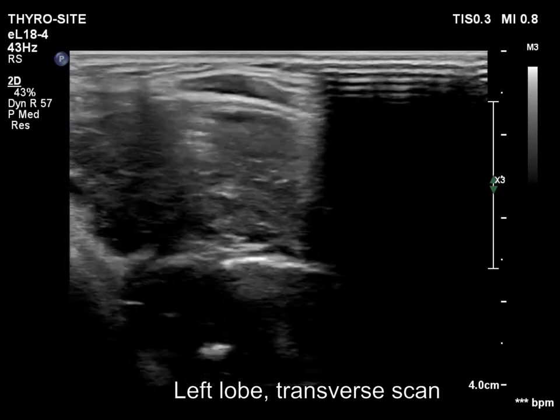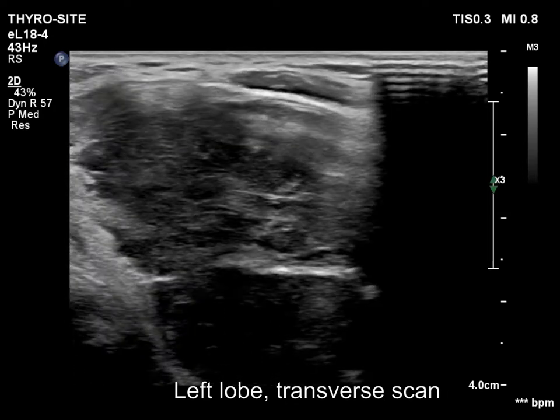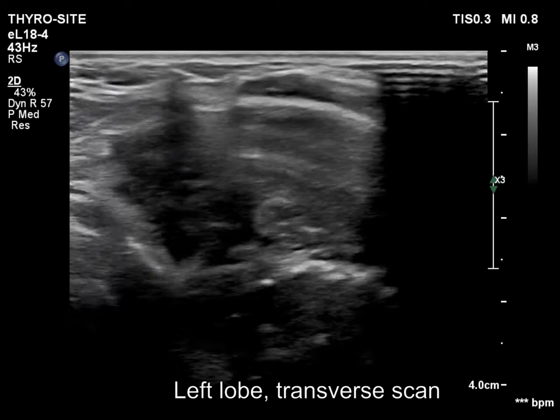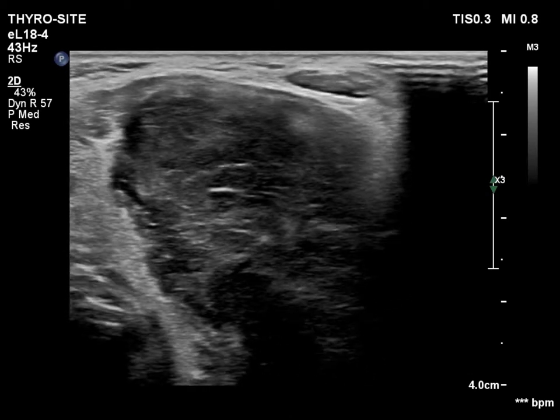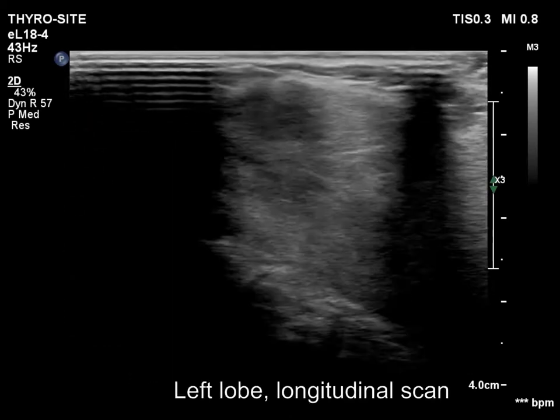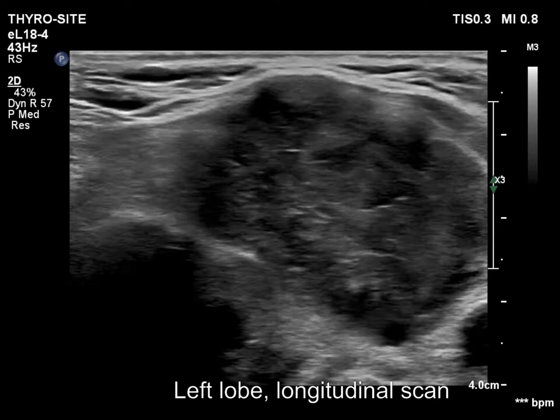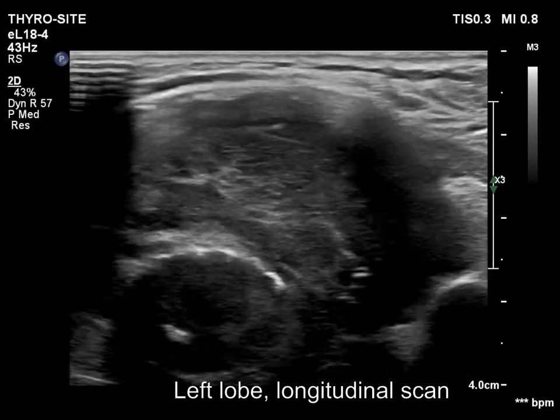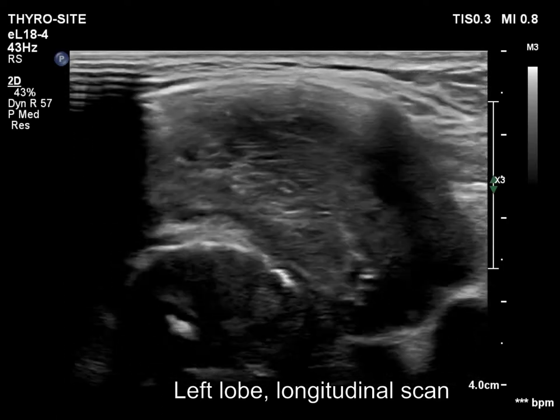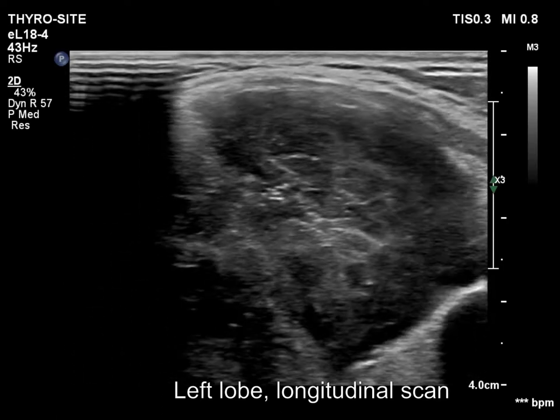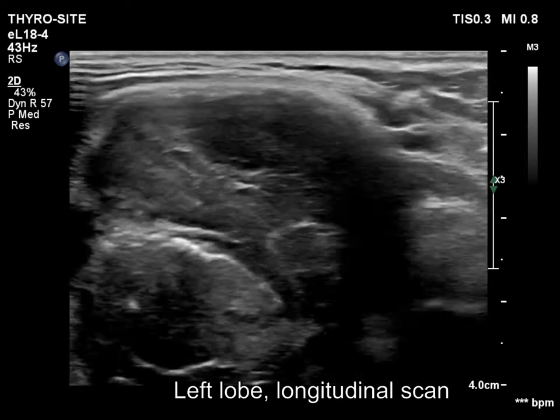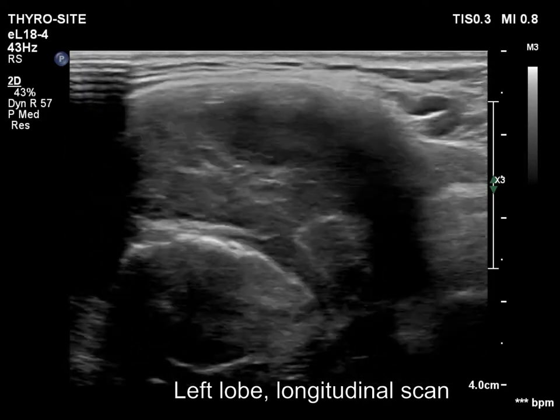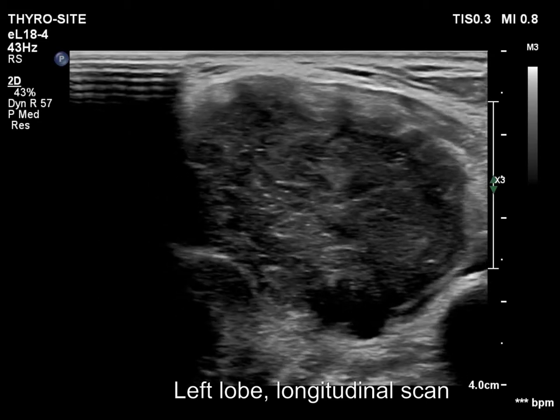A large hypoechoic mass occupied almost the entire left lobe. The mass was composed of parts with different degrees of hypoechogenicity. The tumor presented irregular, lobulated margins. The cystic areas in this case probably correspond to necrosis.